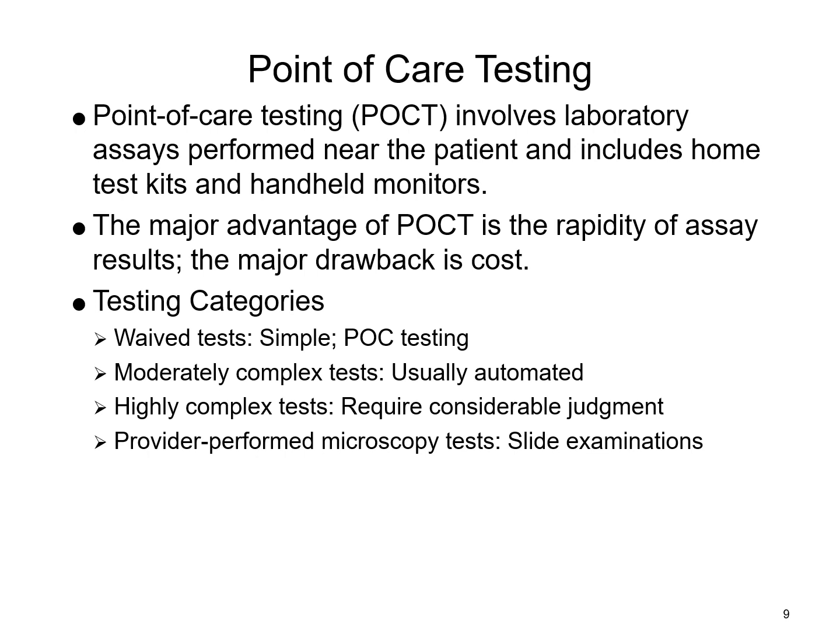One of the drawbacks is cost, particularly if you have a large volume of testing that is done. So, for example, some of your laboratories may switch over to an automated test method if they're just unable to keep up. I know with some of the PCR testing, some of these labs that were doing the point of care testing were going through several kits a day.